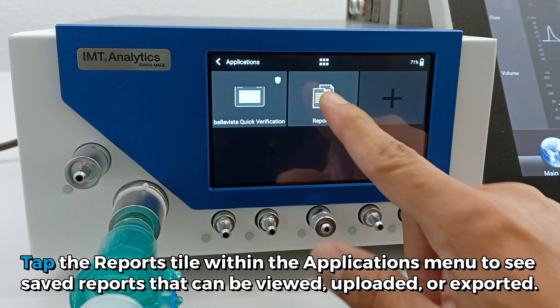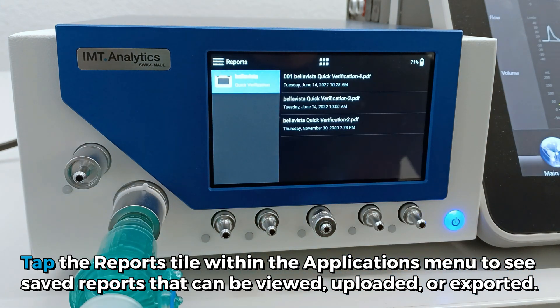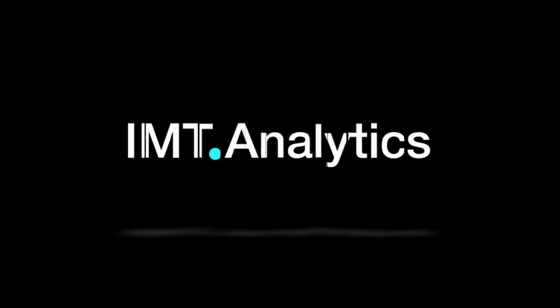Tap the Reports tile within the Applications menu to see saved reports that can be viewed, uploaded, or exported.